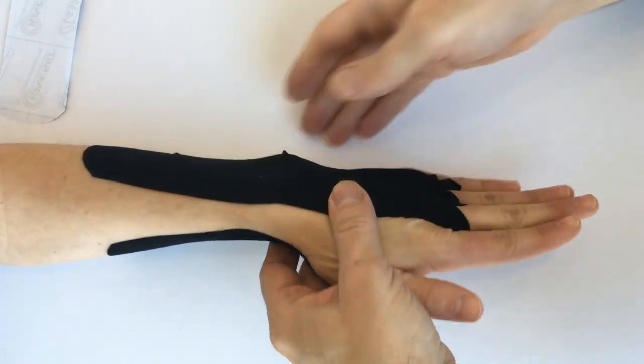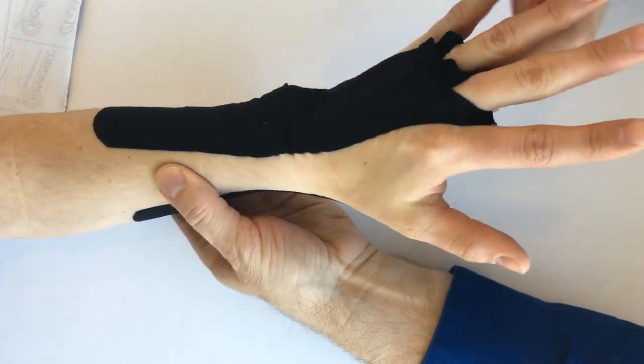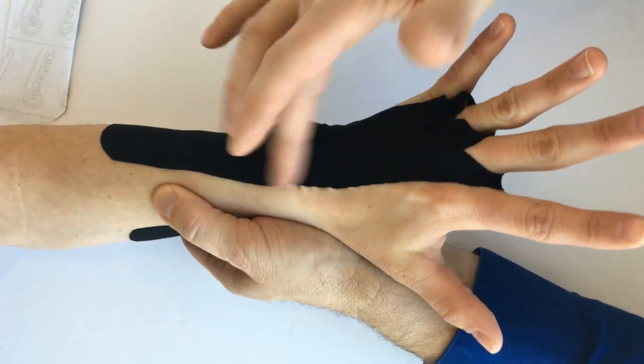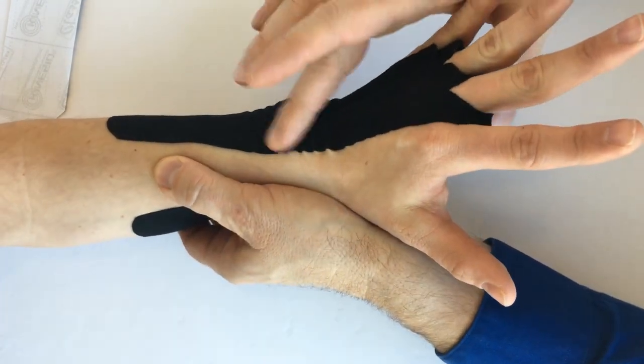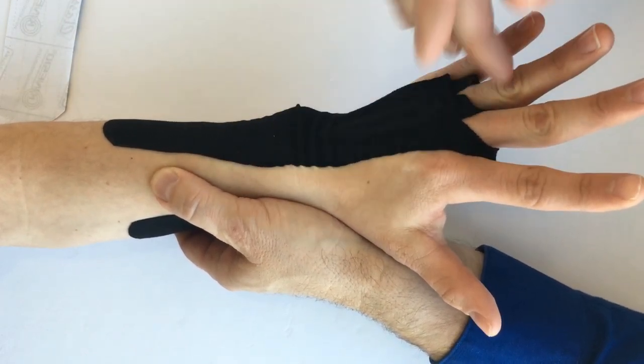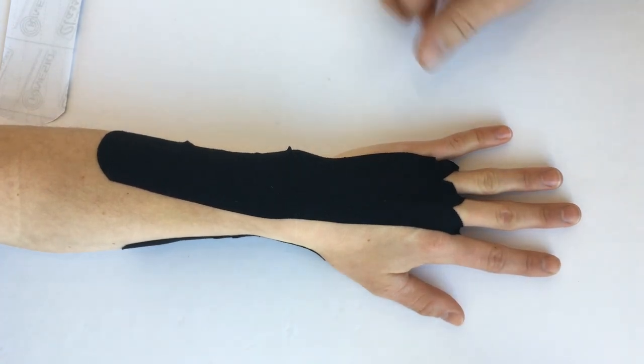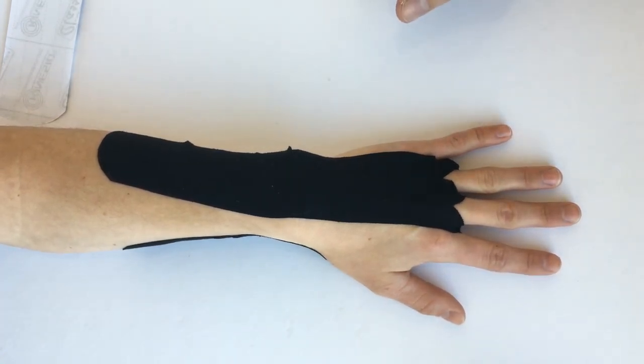One of the things you'll notice is that when the client moves their fingers or wrist, you'll get all these wrinkles in the kinesio tape, and all those wrinkles will pull on those anchoring filaments and stimulate those initial lymphatics to pull the edema out of the hand and wrist.